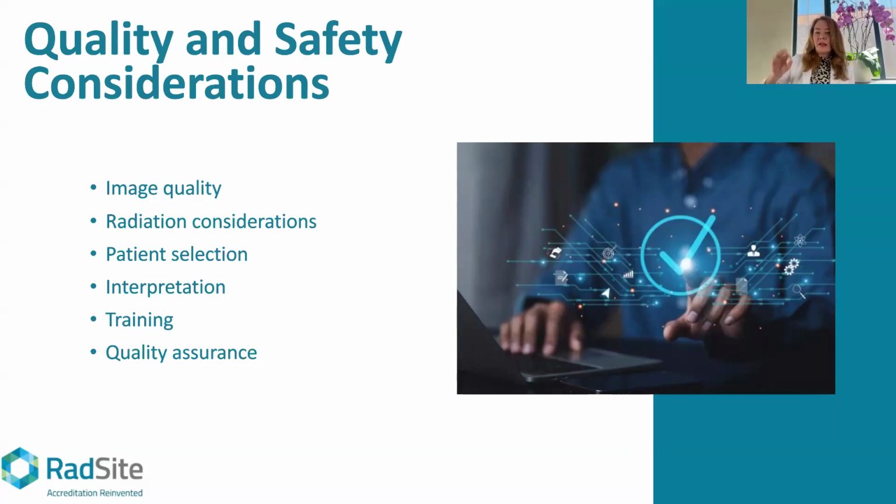And what we saw was a very small area of calcium deposits, just a centimeter, like my pinky fingernail. But beyond that was enhancement, extra blood flow all around that area, where the concern was, wow, this could be disease that's far beyond just the tiny calcium deposit pattern we see. So I talked to the patient about her choices and said, well, we don't really know what this is. Our choices are, we could just remove the area where we know there is cancer and see how clear the edges are. We could attempt a lumpectomy.